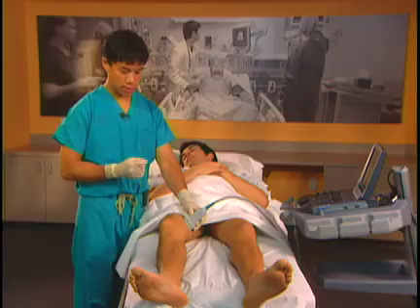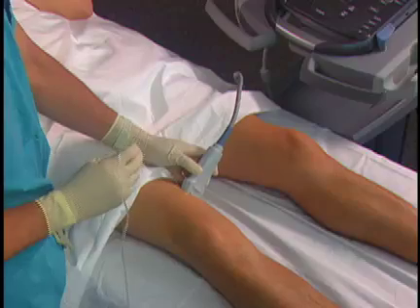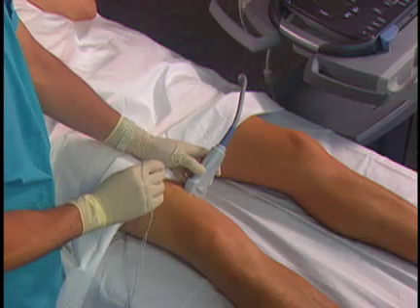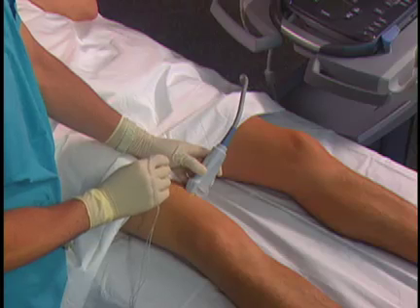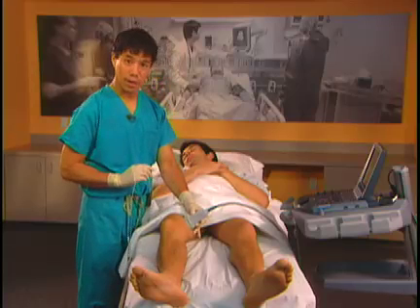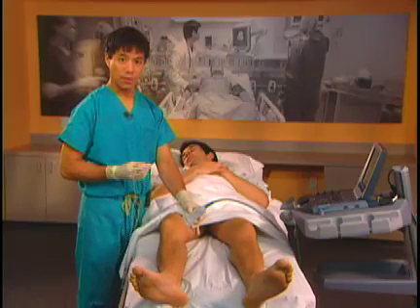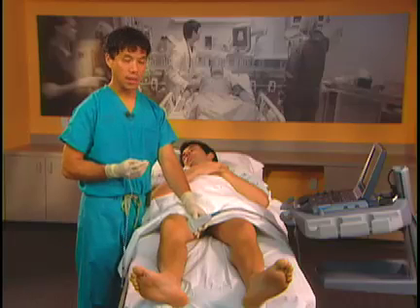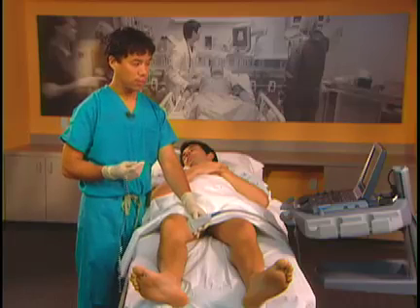Most of the time we're doing a field type block where we deposit the local behind the sartorius muscle and expect that local to reach the nerve, because these nerves can be difficult to see in obese or elderly patients. Our needle approach uses a 10 centimeter needle, inserted a few centimeters away from the probe. We like to see the needle in a shallow plane and then advance it deeper below the sartorius muscle. This block can also be performed if the patient is prone. Typical volumes are between 5 and 20 milliliters of local anesthetic — if a good nerve is seen, usually a hyperechoic structure, then 5 milliliters; most patients we place 10 milliliters as a field block.